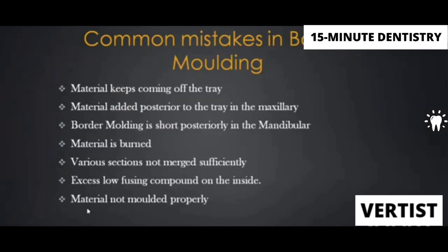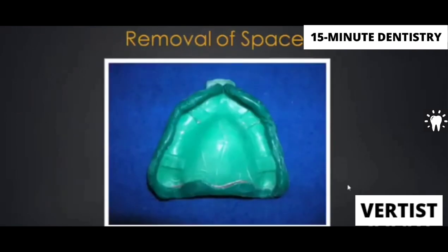And material is not molded properly many a times, because you don't heat the material sufficiently, or you are afraid to mold. Don't do that. Ensure that you have heated the material sufficiently, tempered it nicely, place it in the patient's mouth, and then do nice movements. Don't be afraid of hurting the patient. Don't hurt the patient, but do some nice movements.